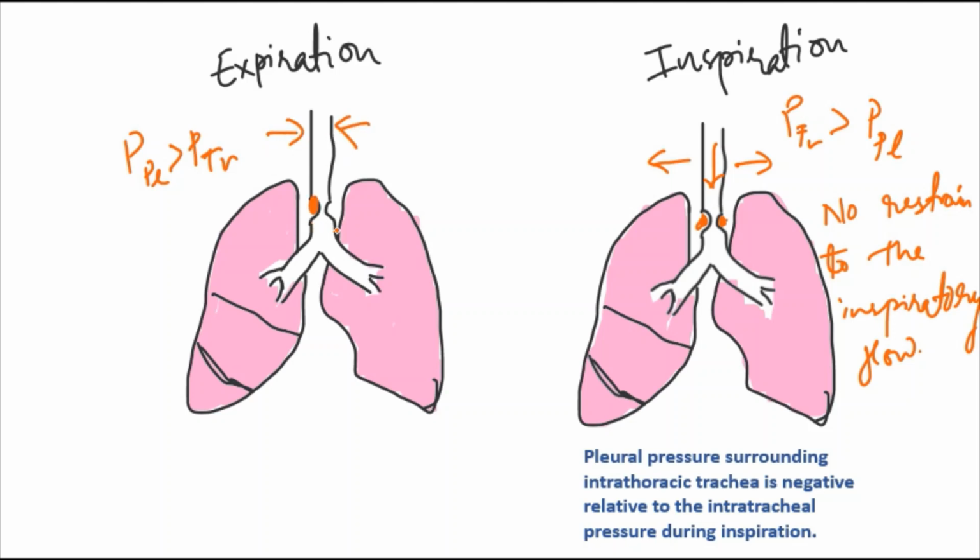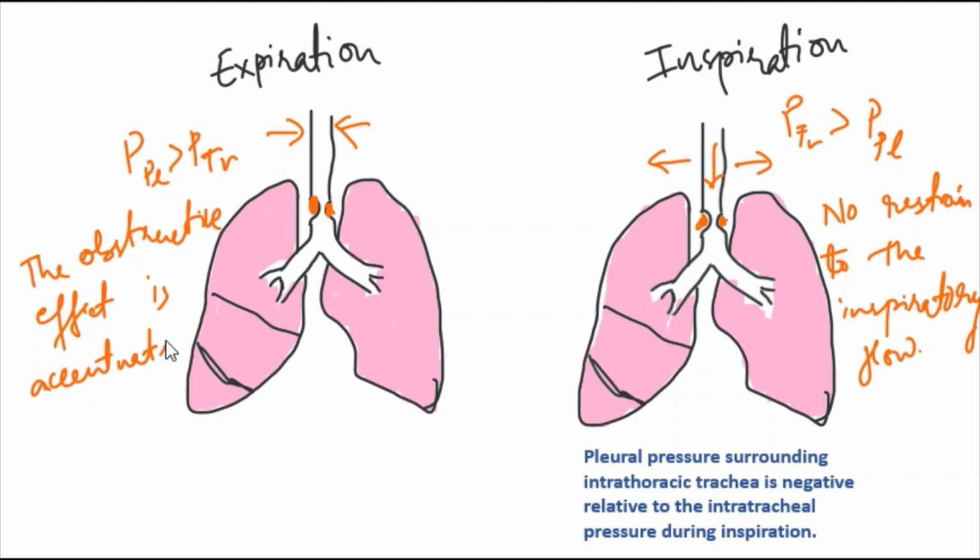So any obstruction that is present over here, the obstructive effect is accentuated. So there is difficulty during expiration in case of obstructive lung disease, but not during inspiration.